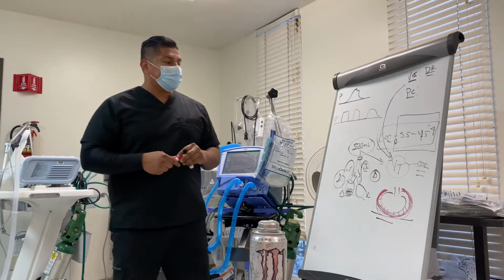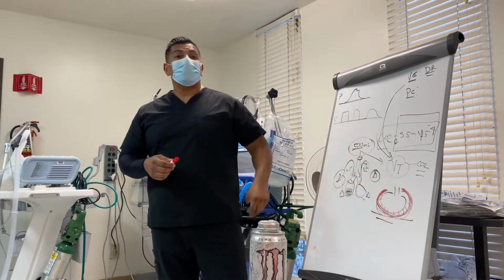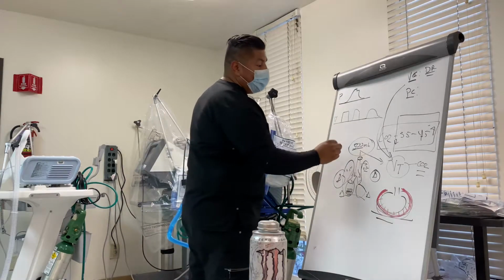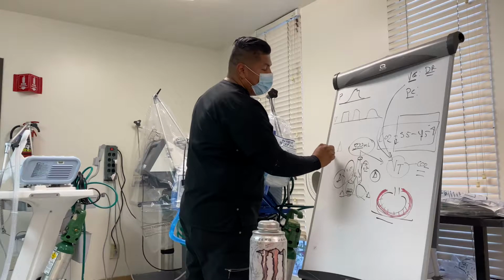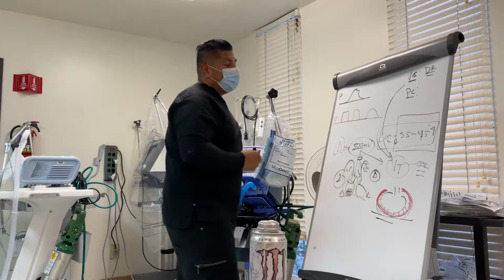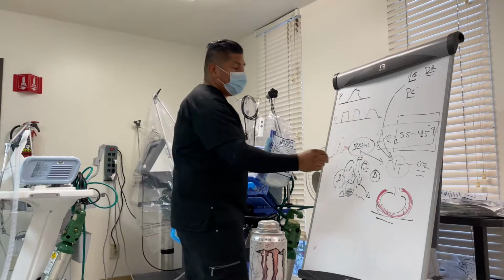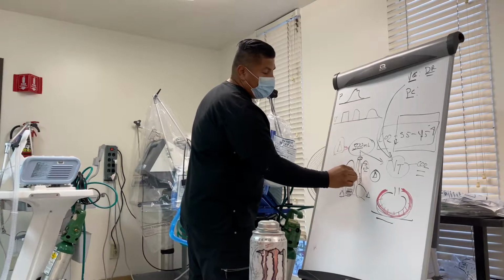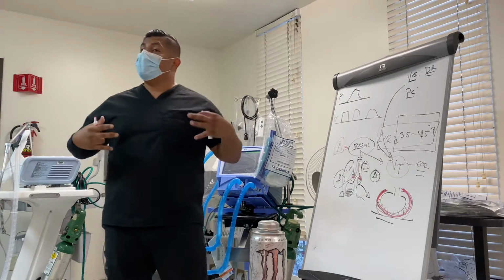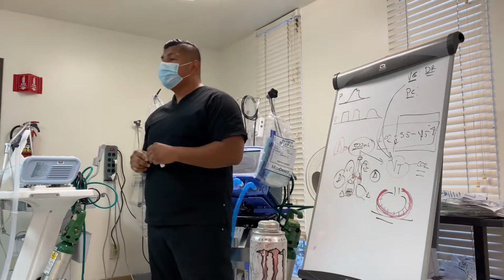So what do we do? Well, we can avoid this from the beginning. And how do we do that? Well, we have modes that can automatically adjust the way that the volume is delivered, so that the lungs are protected more, minimizing any type of micro damage, right?